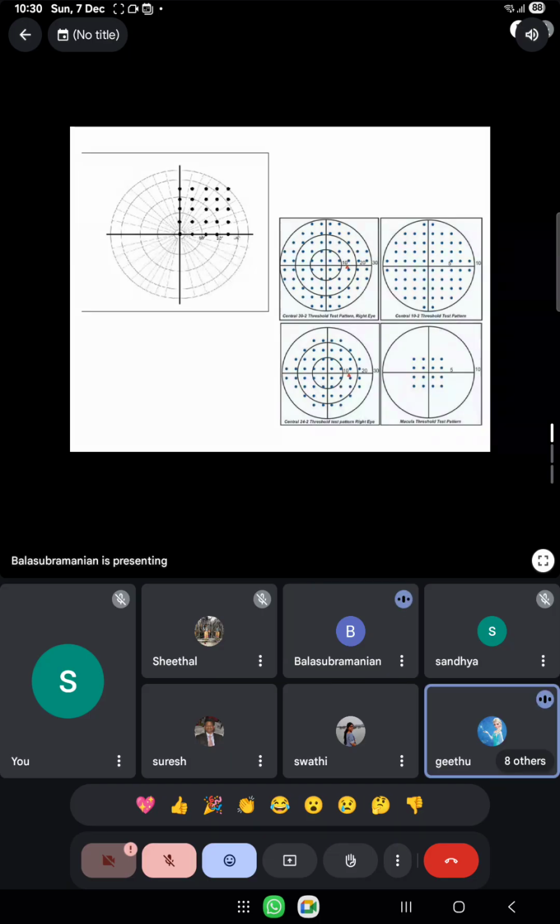For advanced glaucomatous cases, yes, we also can. In glaucoma, the recent guidelines are to assess the GCC through OCT and 10-2, before calling there is no evidence of glaucoma. In any glaucoma case, we can have more details about the macula. 10-2 is not only for macular diseases, also in glaucoma. It gives a more magnified view of the central area.